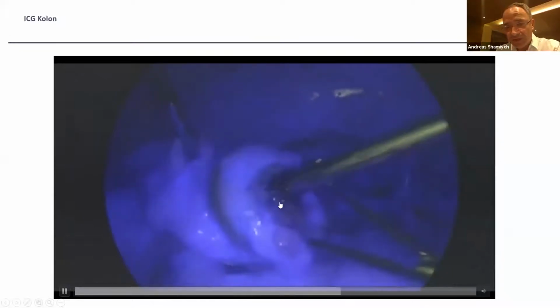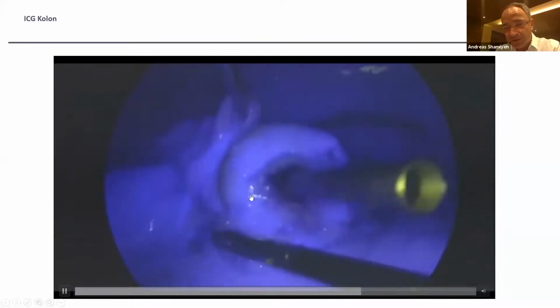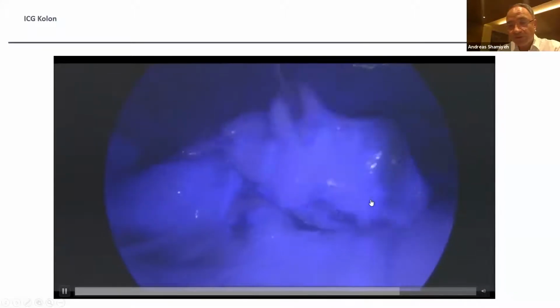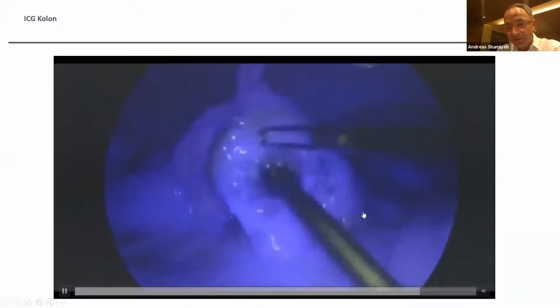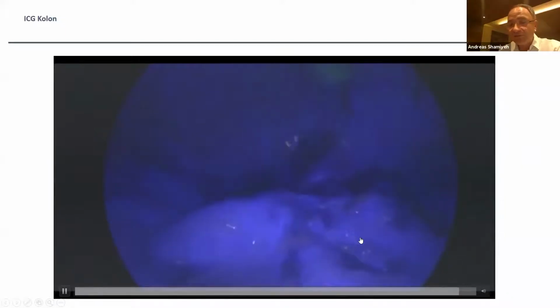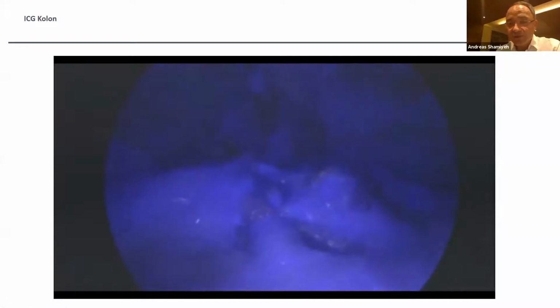Usually, of course, you have to do this ICG demonstration before you put in the anvil. But you can see here the blue color completely surrounding. This is one of the differences between the systems. If you use it from one company, I don't want to name it, it's blue. And if you use it from the other leading company on ICG, you have it in green color.